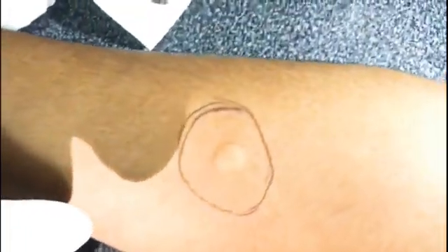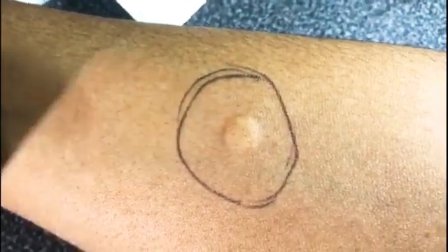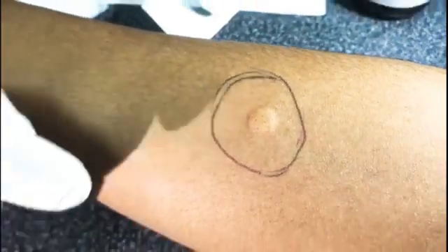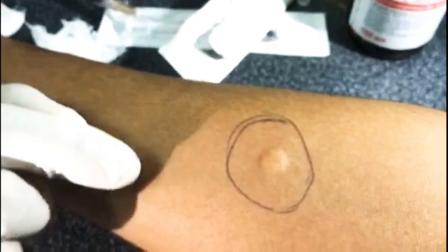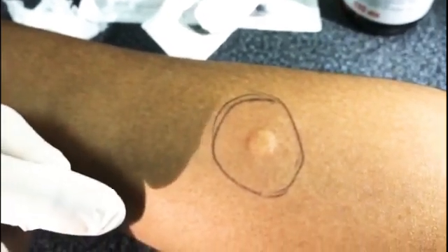This is the papule which we should see — approximately 7 mm. If you see the papule, the intradermal injection is done and it is perfect. If there is no papule, then the intradermal injection is not perfect.